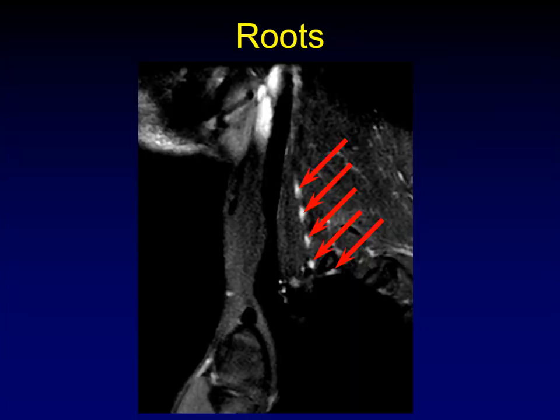Now let's look at this anatomy radiologically on sagittal images — parasagittal images off the cervical spine extending out into the arm. First, the five major nerve roots: C5, C6, C7, C8, and T1 tucked under the first rib. You can take sequential images more medially and trace these back up to the cervical spine to confirm each nerve root.